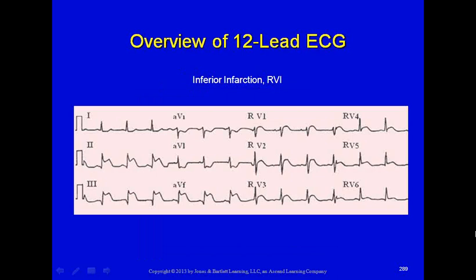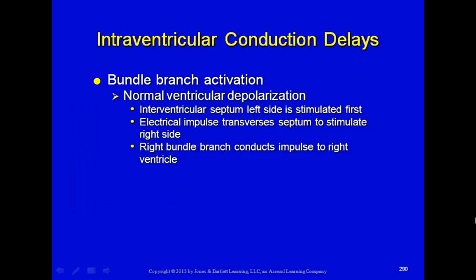indicating an involvement of the right coronary artery. But then I want to focus my attention on right V4, up there in the top right. In right V4, I do have some elevated ST segment there. It doesn't have to be much. It just has to be more than one small square. And if it's more than one small square, then I know that the right ventricle is involved, and I'm going to be really cautious with administering nitroglycerin or morphine.